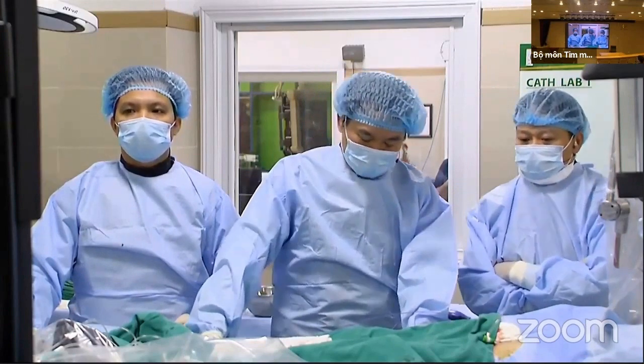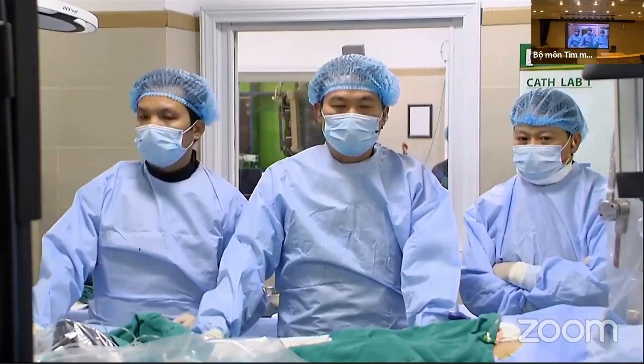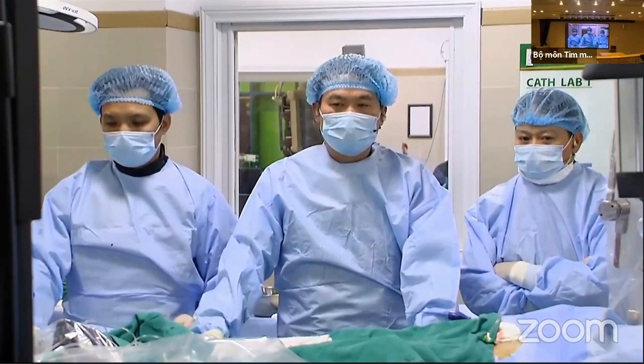I think I agree with him that we should cover the LSA, because there is a high chance that it will close and then cause thromboembolism.